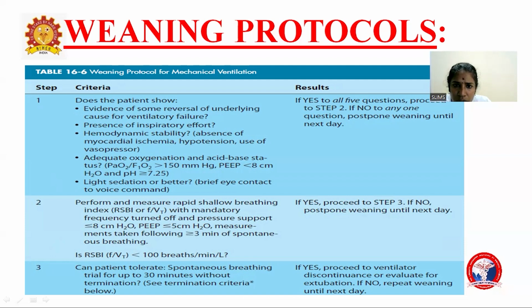Then adequate oxygenation and ABG status, that is PaO2/FiO2 of more than 150 millimeters of mercury, PEEP should be less than 8 centimeters of water, and the pH should be more than 7.25, and light sedation or better, where eye contact or voice commands are followed. If everything is yes and all the patient criteria are met, then you should proceed with weaning. If the answer is no to any one question, postpone your weaning until the next day. So in the morning, when you go for rounds, you should look for this.